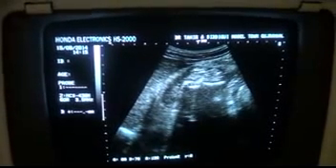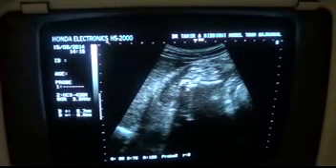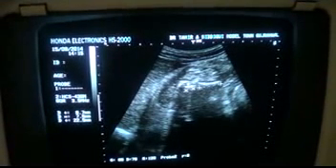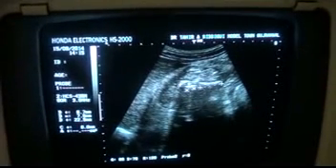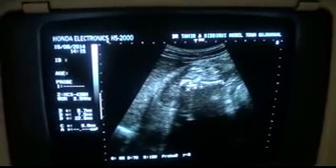There are calculi seen, one at the upper pole, this is also at the upper pole, and this one is running from the mid-region calyces to the lower pole calyces. And you know, this is the upper pole of the kidney, this is the mid-region of the right kidney, and this is the lower pole of the right kidney.